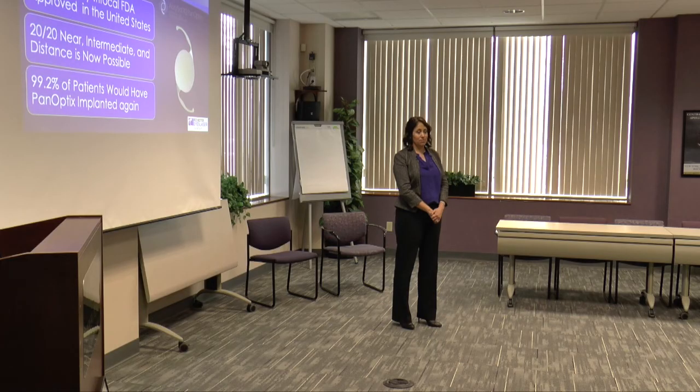So you don't use the hard lens anymore? No, the PMMA lenses were the standard when I went into ophthalmology. Beautiful lenses, wonderful material, but they don't fold. So the smallest incisions we got those through were 5 millimeters.